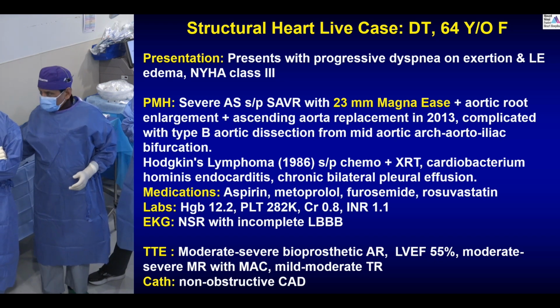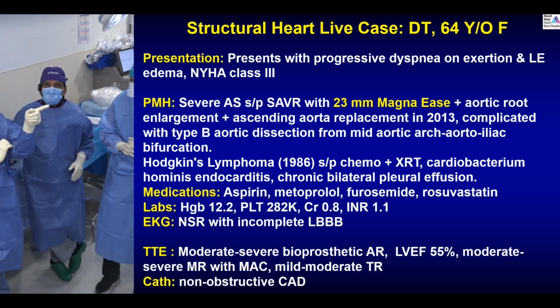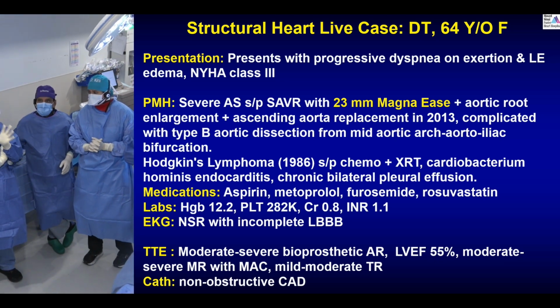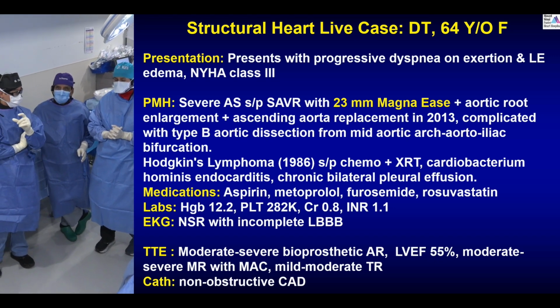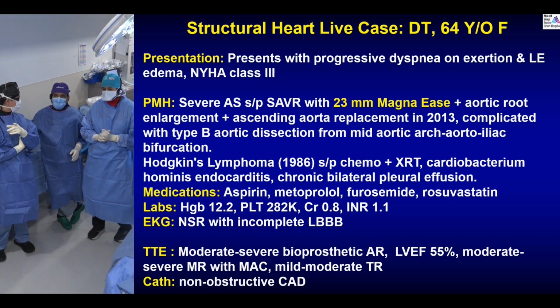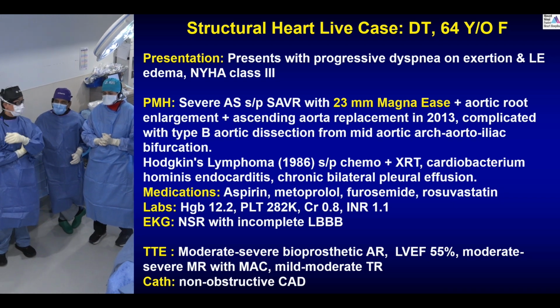Yeah, Gilbert? Yeah, no, this is a very challenging case, even looks deceptively simple. You can actually show aortogram in the CT. Patient actually has a porcelain aorta, despite the ascending aortic replacement, which is a very short graft, and very likely because of Hodgkin lymphoma radiation. Back then, you know, they were very extensive due into radiation. The type B dissection, I think, will make it challenging from an access standpoint. We'll talk about that later.